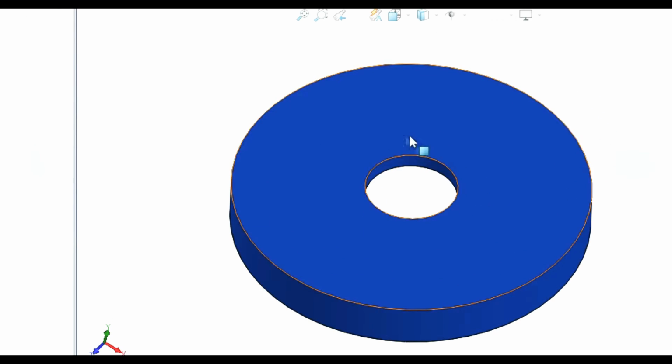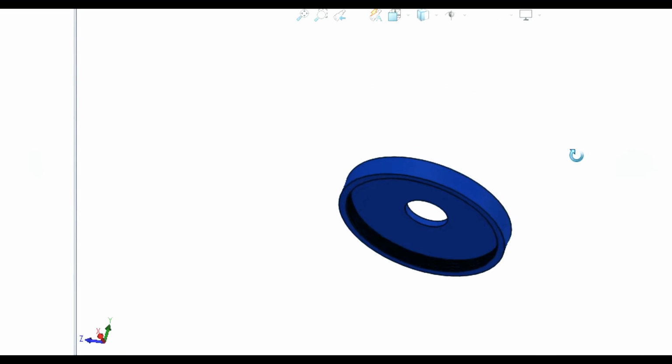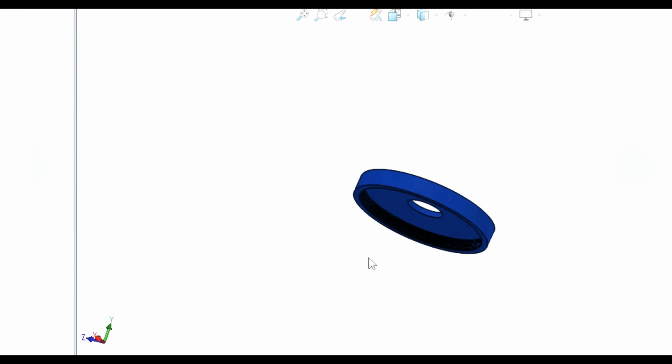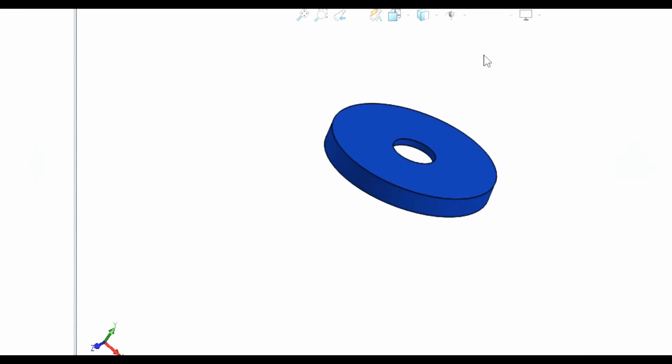A hole can be drilled into the center of these caps to provide for the movement of the piston and connecting rod, and a pathway through which the oxygen carrying tube can be passed through.